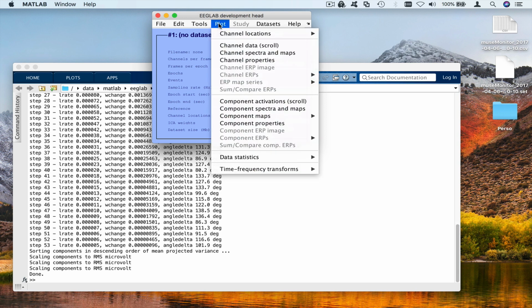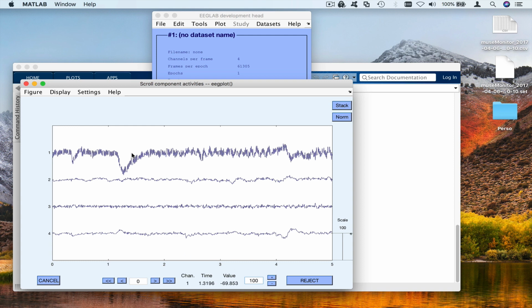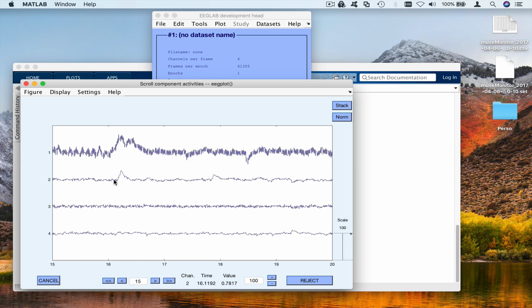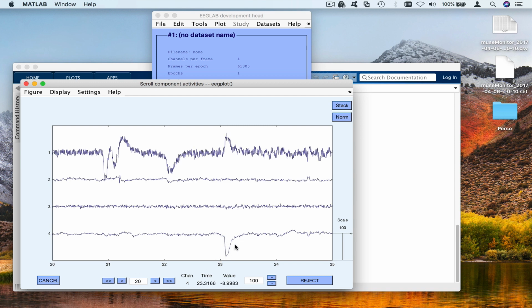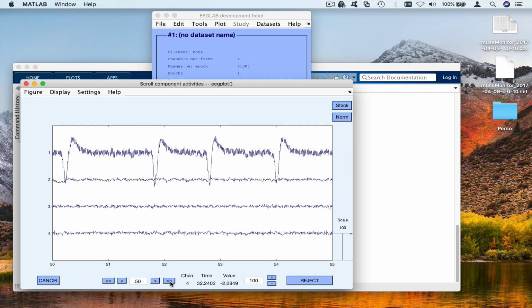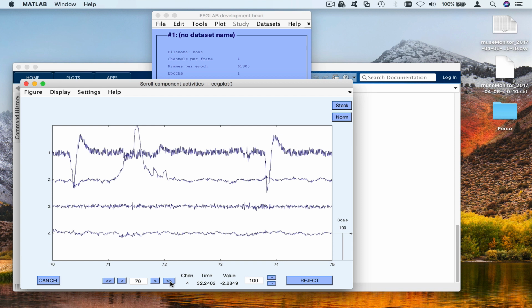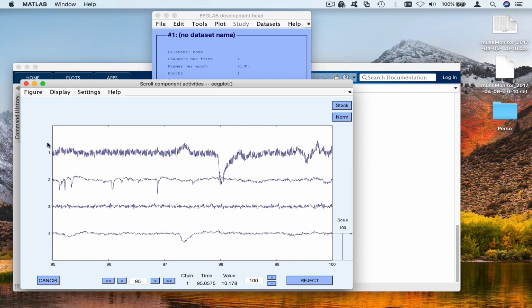And now I'm going to look at my component plot, channel activation components. I'm going to change the scale. And so we can see, you know, the first component has captured a lot of the noise. There's still something in component 2, and then you see here component 4 also has some changes. But we don't want to remove more than one component because we only have 4 channels. And there's consequences to removing components. So we want to remove one component at the most, the one that's like the most important.